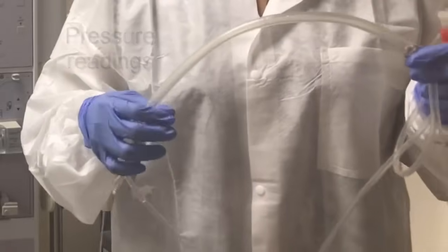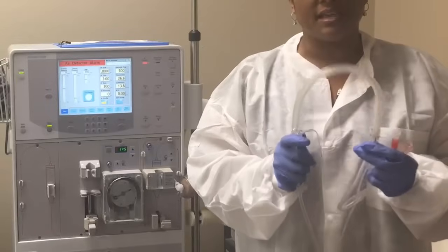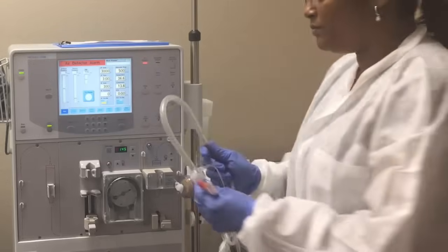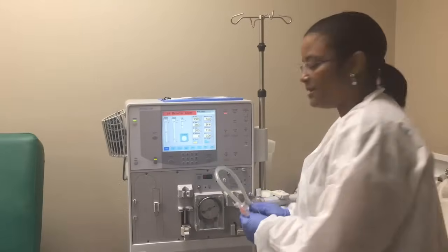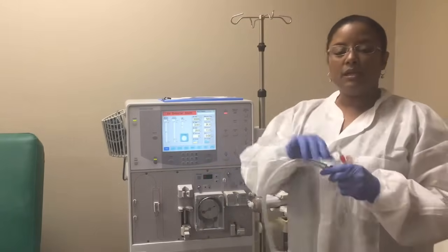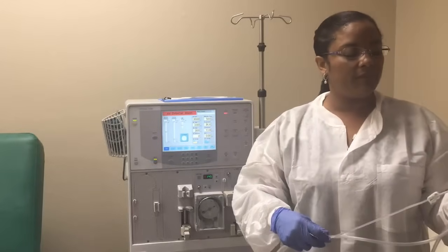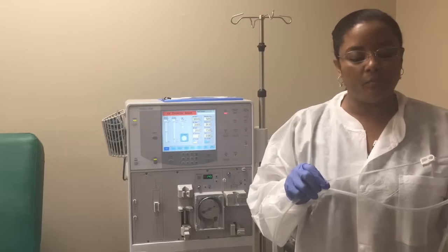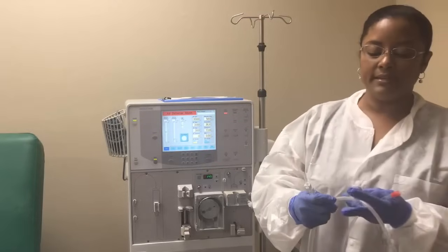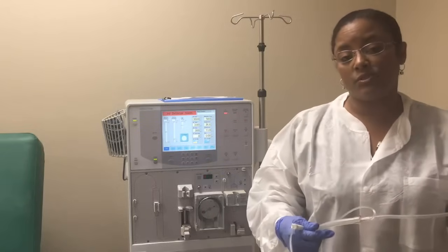After the pod we have this large segment right here called the pump segment. This segment is intended to go inside of our blood pump. If we keep on moving, we have another thin line here with a clamp and a cap — this would be for heparin, this is the heparin line. The other end is the end that's going to get connected to our dialyzer.